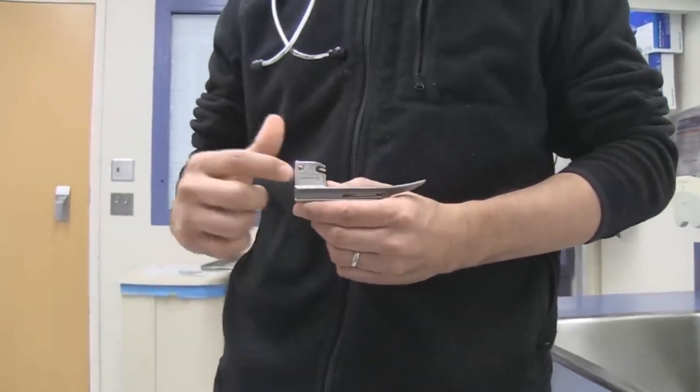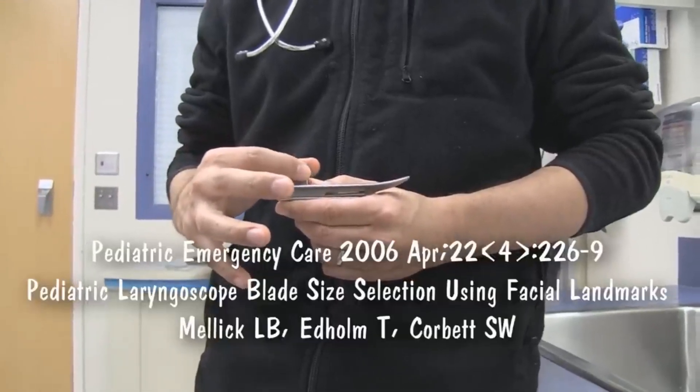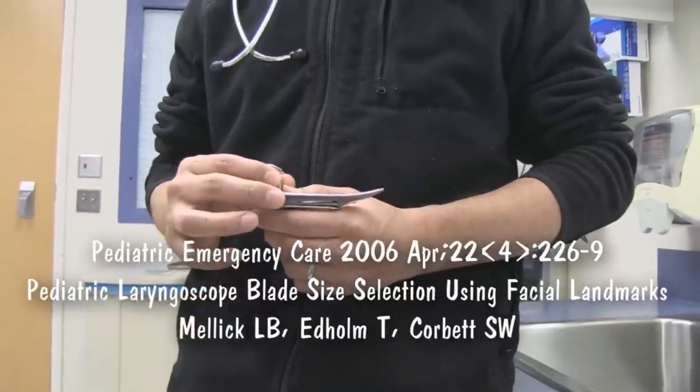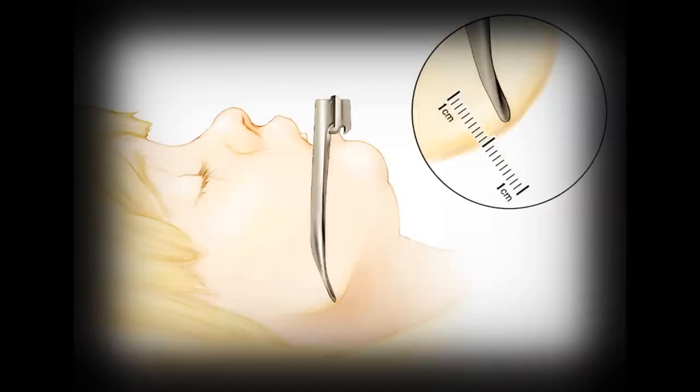The theory is that if you place the base of this laryngoscope blade at the central incisors externally — the upper central incisors — the tip, the distal portion of the blade, will be plus or minus one centimeter to the angle of the jaw. And that's the correct blade length. Based on her age, this is a starting estimate as to whether this will work, so let's place it next to her and see if she needs a bigger or smaller one.